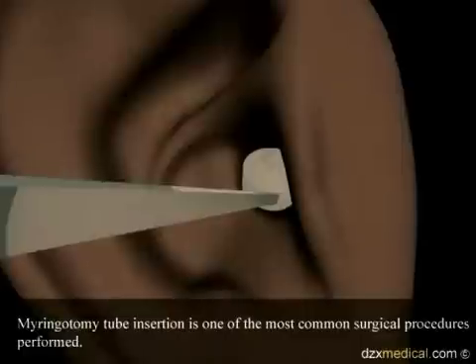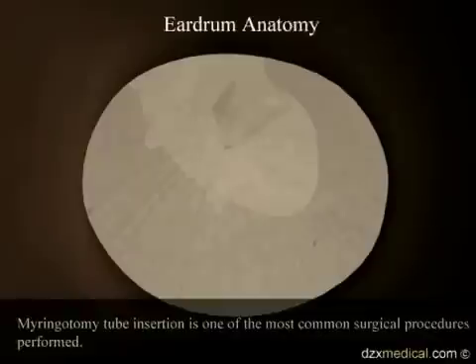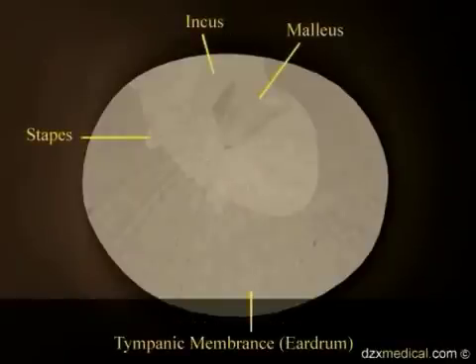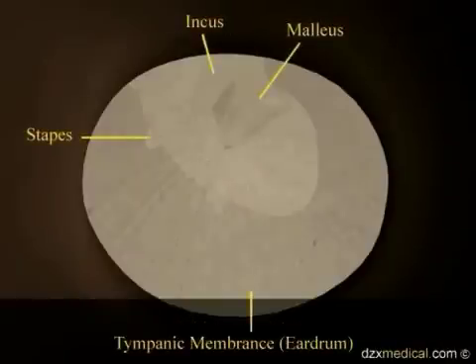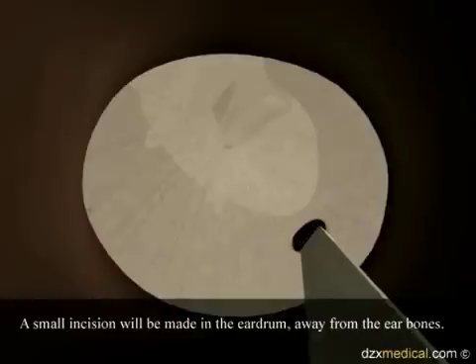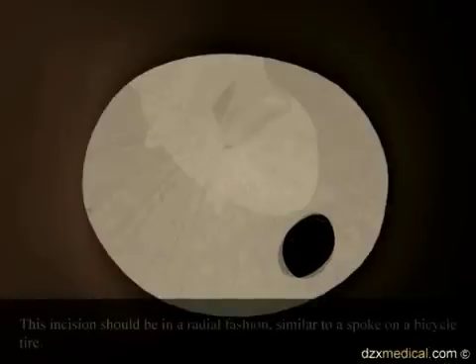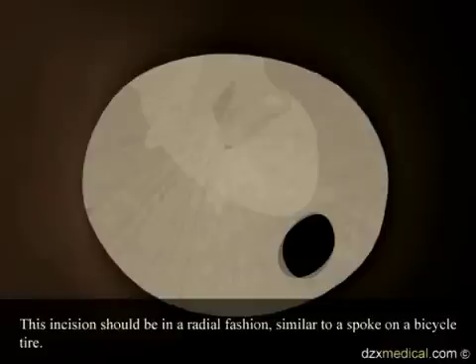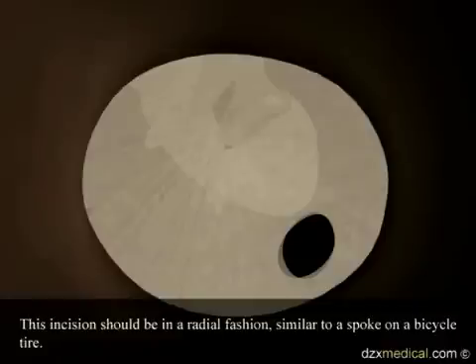Myringotomy tube insertion is one of the most common surgical procedures performed. A small incision will be made in the eardrum away from the ear bones. This incision should be in a radial fashion, similar to a spoke on a bicycle tire.